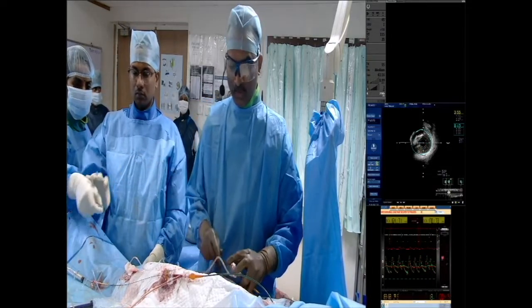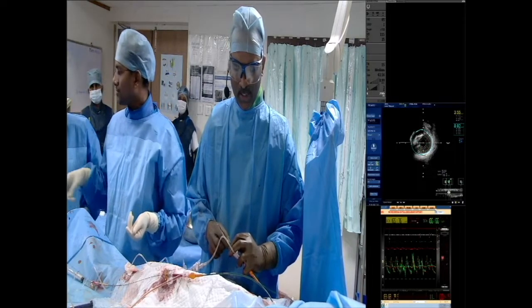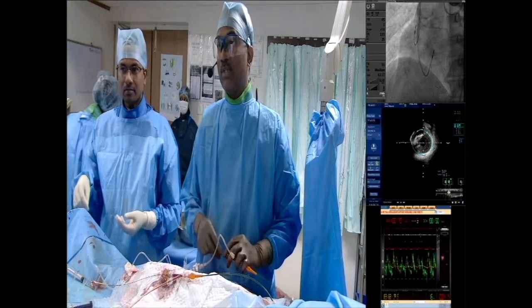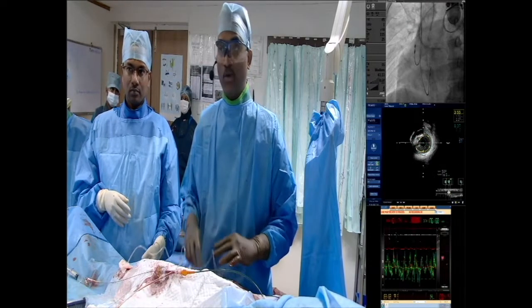So for the entire procedure, that's what happens when you use a retrograde wire as a marker. We can close it with as little contrast as possible. But the key here is the easy crossing of collateral.